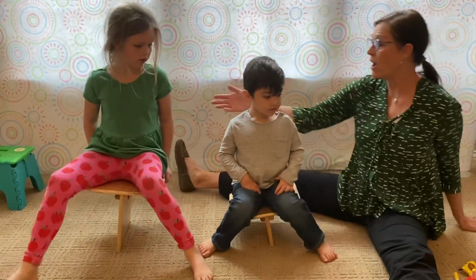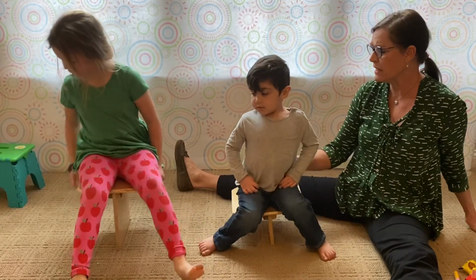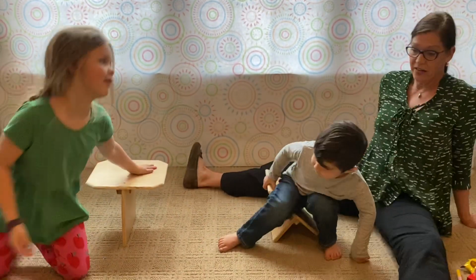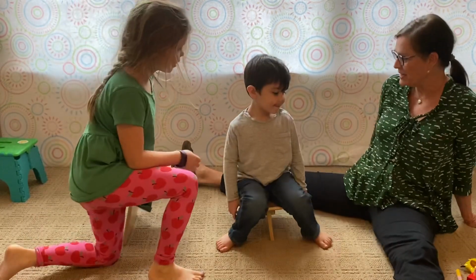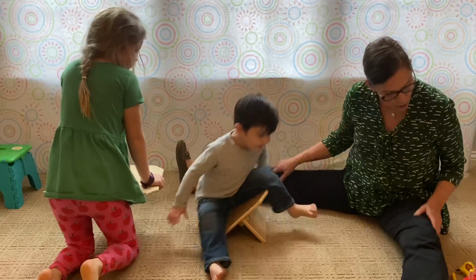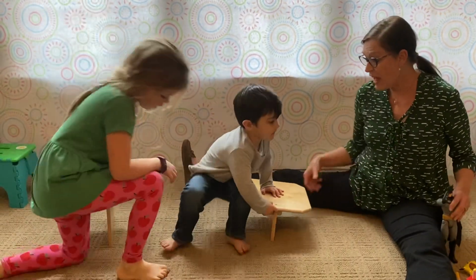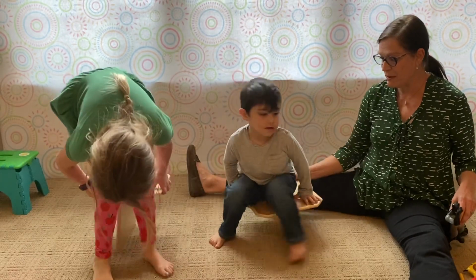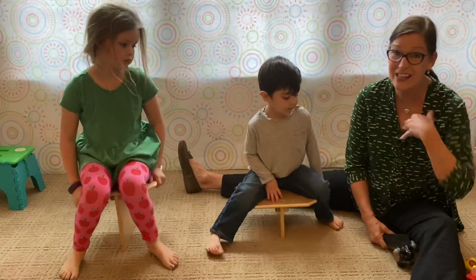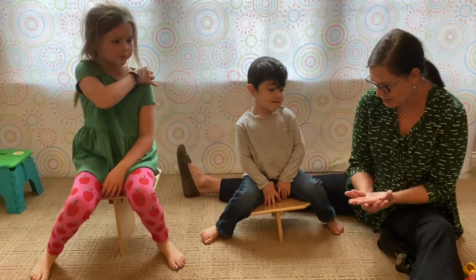A lot of time I also work on children's lower back extension with just the most gentle input to get them to have that. It's kind of fun. It is actually kind of fun. Now we get some nice imitation. It's the sincerest form of flattery. So if you were to see, perfectly fine. And then this is called motor planning, to be able to get back on it independently. So it's really good for children to have that degree of mastery over their posture when doing this.